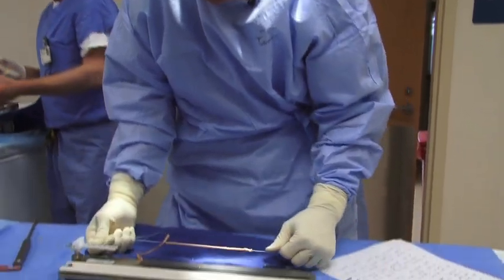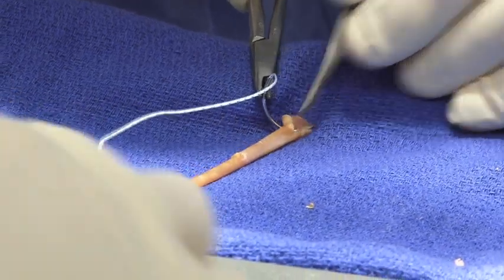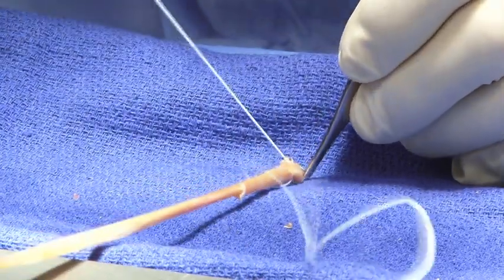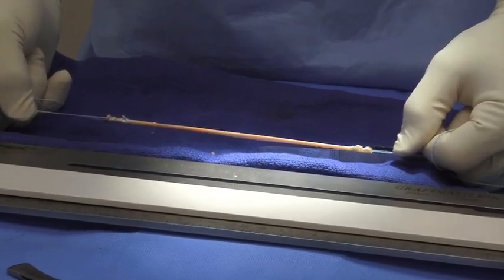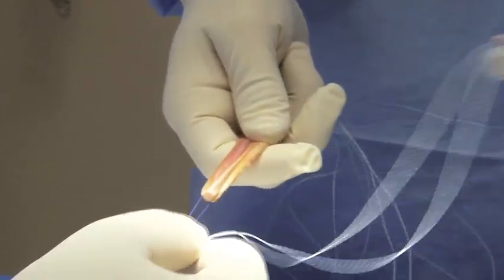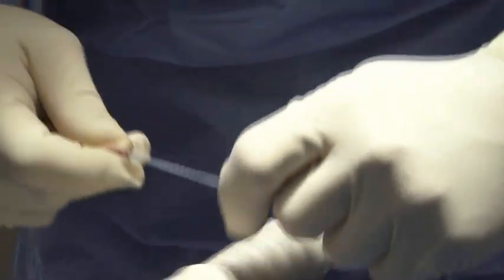The double-stranded graft of semitendinosus is pre-tensioned, and the double-strand graft of the gracilis is also pre-tensioned for a short period of time. A suture is used to double the four-stranded graft, and then the fifth strand of the graft will be brought up with the smaller end of the graft towards the bulleted end to get a preliminary sizing of the graft.